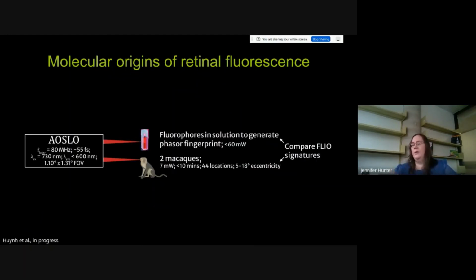I want to tell you one final story, which we are starting to now try to understand. Well, this would be a very expensive cone classification method. It's very invasive, two-photon imaging. You really wouldn't want to use this as your cone classifier.